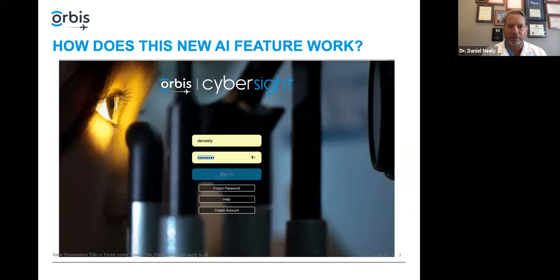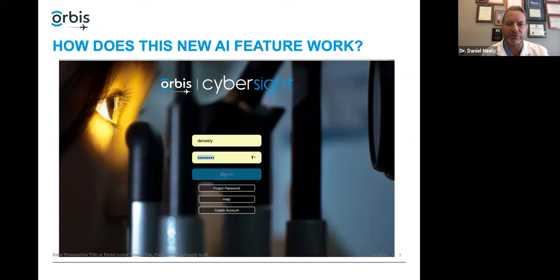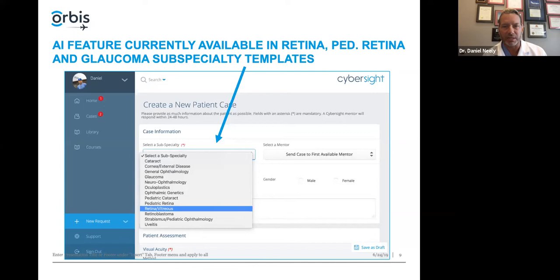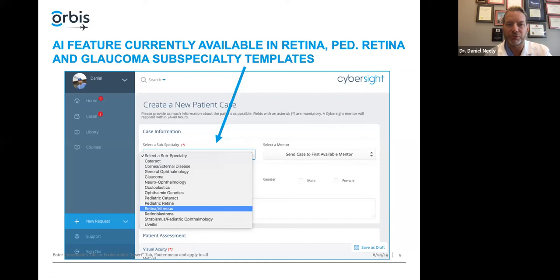How do you use this feature? You just log into CyberSight as normal. This feature is found within the patient case section — you have to be submitting a new patient case; it will not appear if you're using general question. Once you select patient case, you have the typical dropdown of subspecialty menus. The AI feature is not available on all templates. Because it's specific to retina, diabetic retinopathy, and optic nerve findings, it will only appear within one of three templates currently: retina vitreous, pediatric retina, and glaucoma.